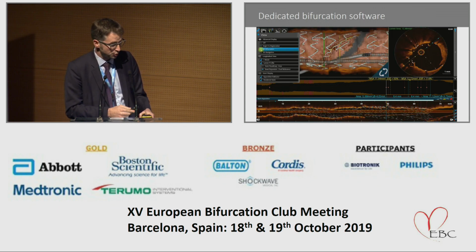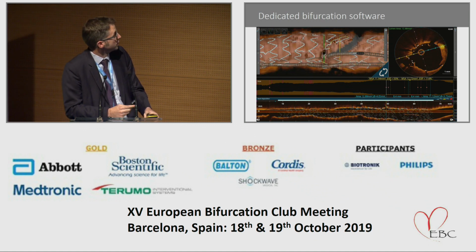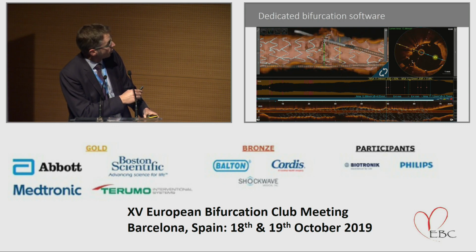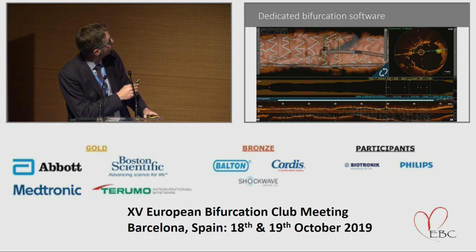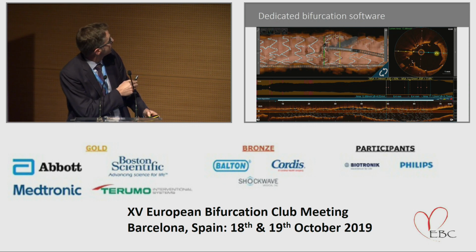The other element to this is that, having had the opportunity to post-dilate before doing the OCT, I placed the wire to ensure we can use the bifurcation software to check that I've gone for an appropriate cross. And we had some fantastic presentations earlier on. Yoshi and Numa showed us where we should be trying to place our wire. And certainly the 3D software gives us that confidence of knowing where we are. Although I must say here again is an area to debate, that we just have a small overhang of strut across the carina. Is this where we want to be, true distal or here?